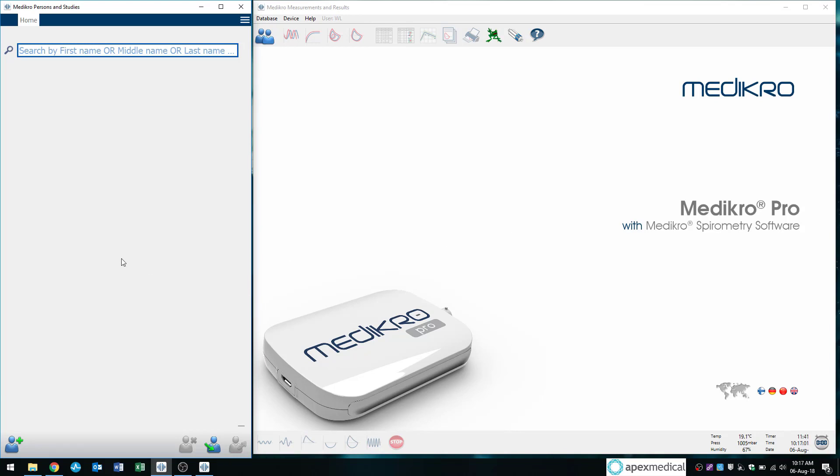So when we want to start testing, we always want to start in our left window, our Medikro Persons and Studies window. And the button I always recommend my clients to press if they want to proceed to the next step is always this bottom left button here.